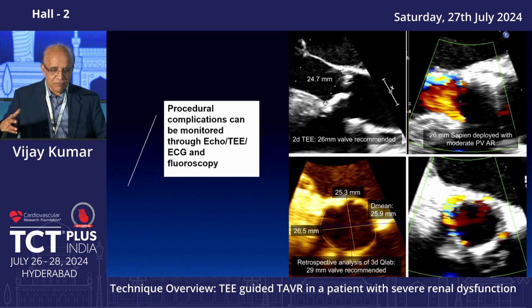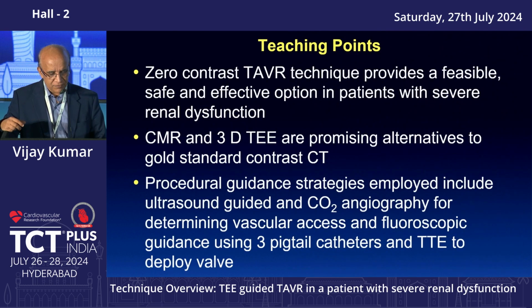The valve was undersized because the different multiplanar views were not assessed properly, and so the operator ended up using a smaller sized device and had a significant paravalvular leak. So one has to be very familiar with TEE, and generally it should be done under general anesthesia, and on the day of procedure it should be ascertained that the size you have chosen depends upon multiple measurements of the aortic annulus in different views.